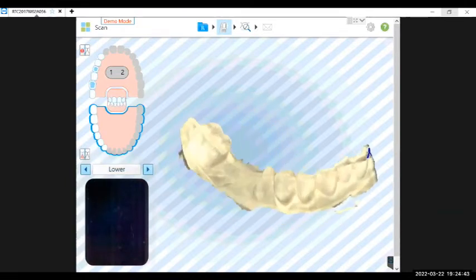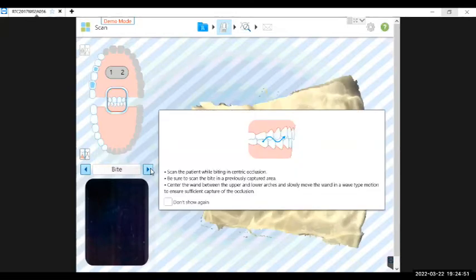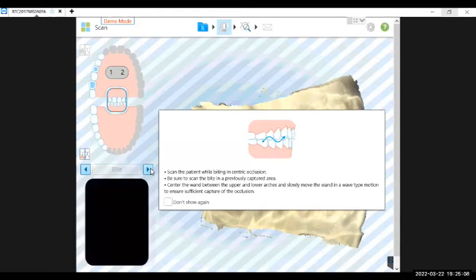Or perhaps you've just anesthetized the patient and it's going to be 5 to 10 minutes before you're coming back to actually prep the tooth. So in that downtime, the assistant could indeed scan the upper, the lower, and the bite registration, so that after you prep the tooth, all you have to do is scan the preparation and those adjacent teeth, just that small quadrant area.